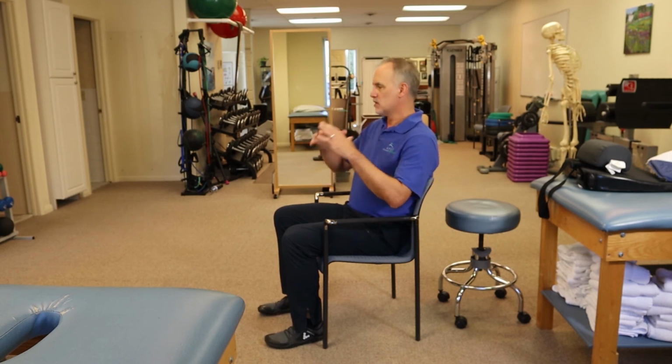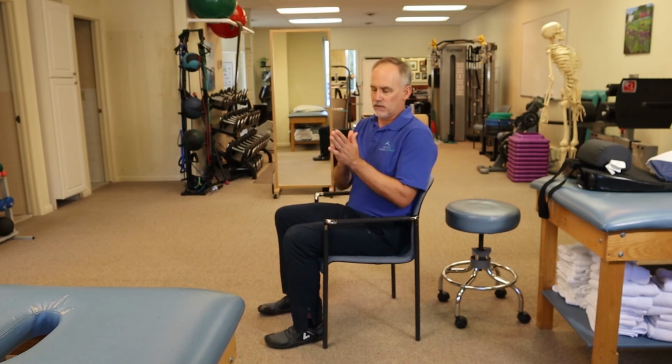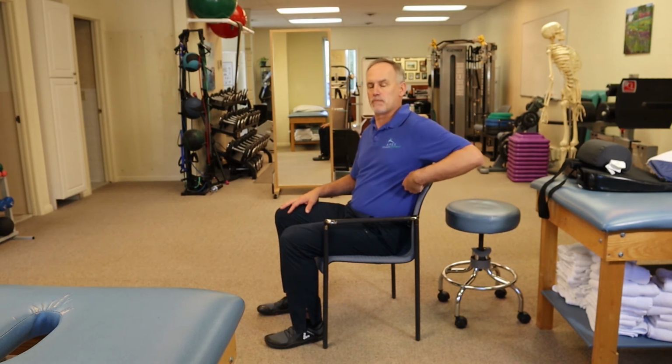This one fits me pretty good. I'm just under 200 pounds, about 6 foot. So this fits me pretty well. A little shorter too, it doesn't have to be exact, there's a range that will fit the person. But someone very petite might need that smaller roll that we described earlier. Lean back into the roll, and you want your upper back to contact the upper portion of the chair.